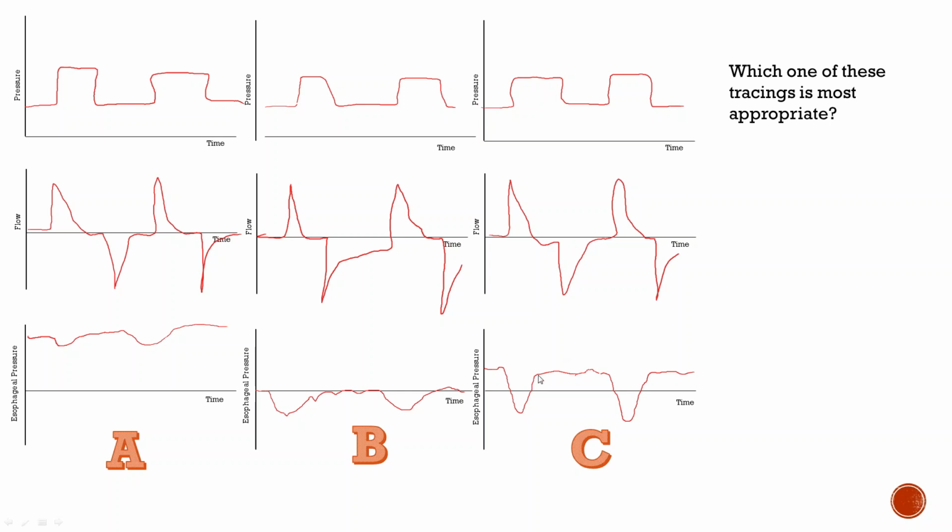If you subtract your esophageal pressure from your plateau pressure, you'll get your true alveolar distension plateau pressure, and you can guide your alveolar distension to that. That's one thing. But the more important thing, I think, is optimal ventilation strategies.